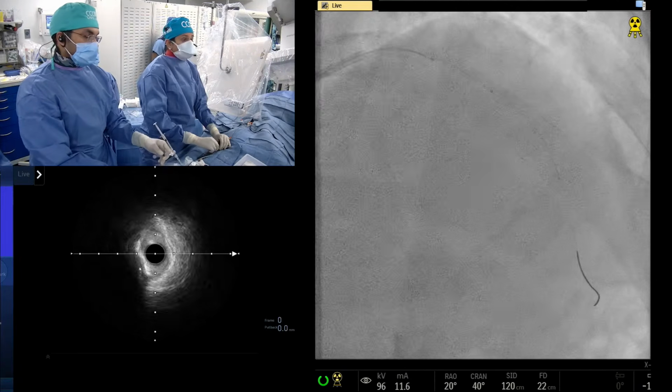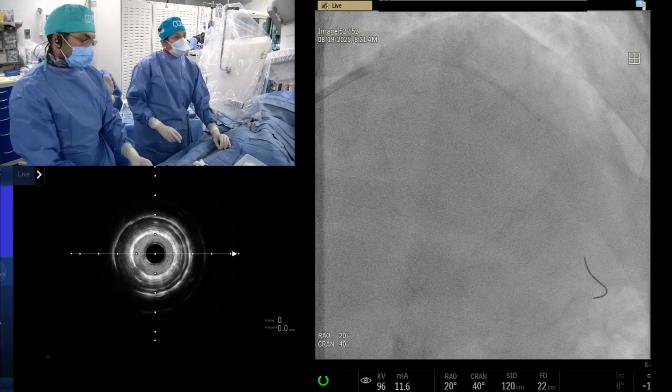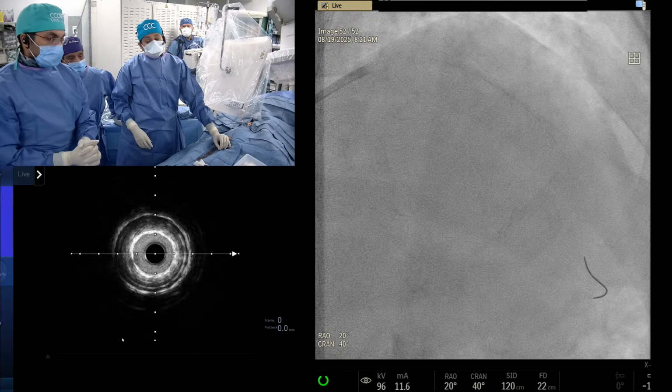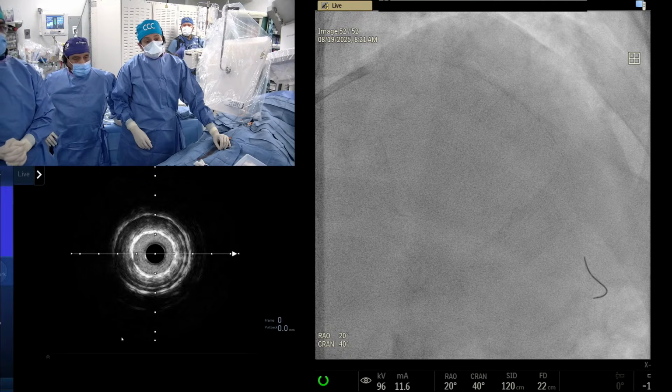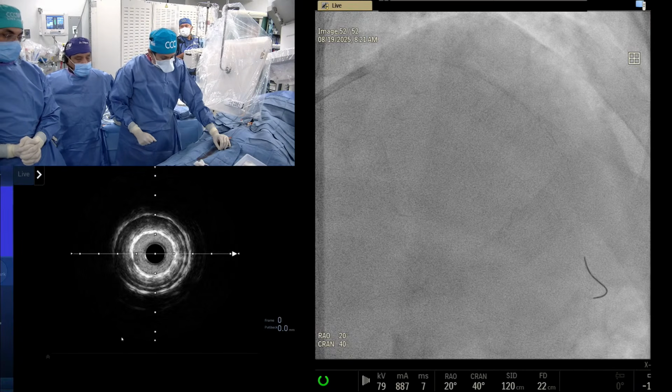Okay. Yeah. No, but what about the balloon? You're in the very proximal area only. You could not go further; it would not go further. So is it not to say that if it did not go further, by definition, all the trials have said that if you could not cross your imaging catheter, it's a severe calcium.